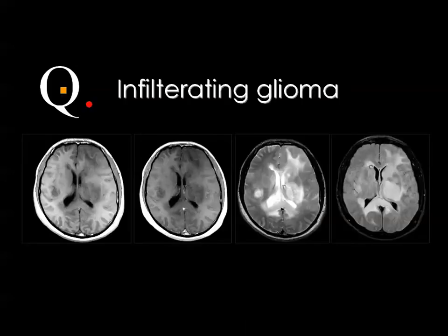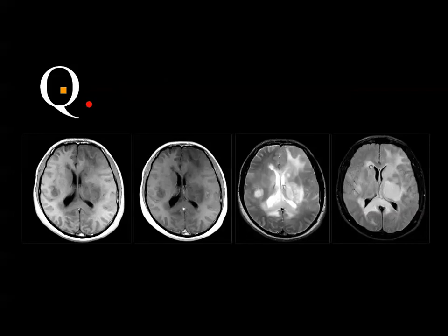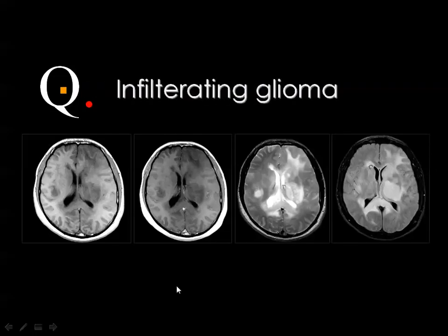Yes, it can. Both can be multiple. Metastases usually show contrast enhancement, and they are more or less well defined, not diffuse like this. Okay.